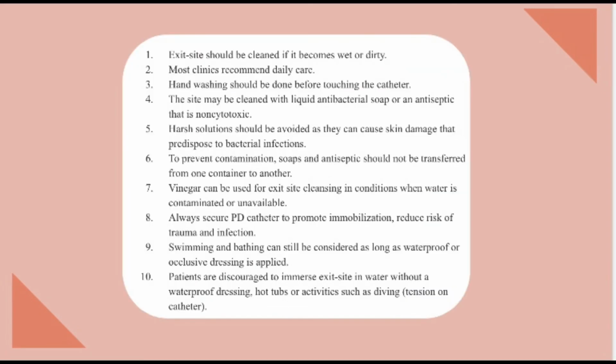What is the long-term care of the exit site? Long-term care of the exit site begins when the exit site is healed, usually 2 to 3 weeks post-implantation. A healed exit site has no gapping, erythema, drainage, crusting, or tenderness. So number 1, the exit site should be cleaned if it becomes wet or dirty. Most clinics recommend daily care.